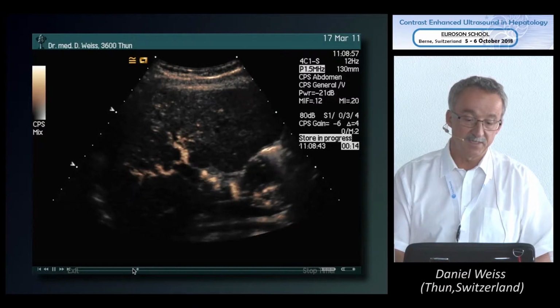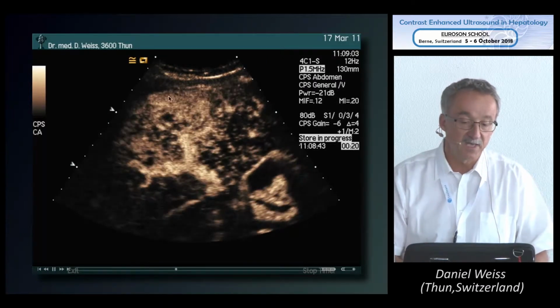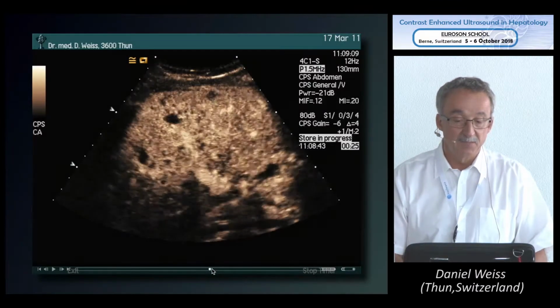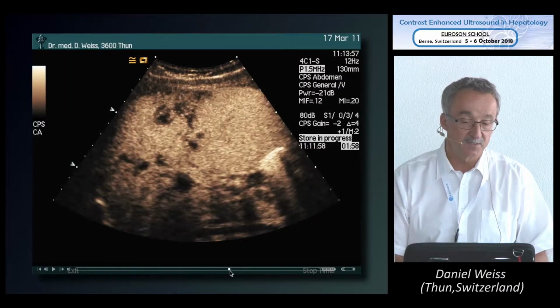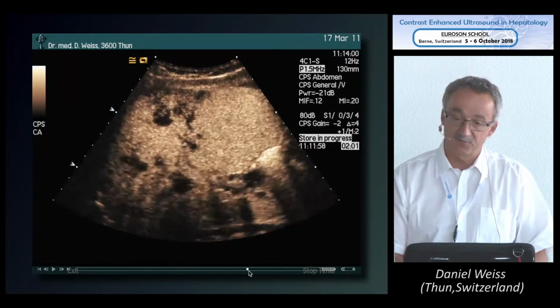And look what's happening. You see again these small calcifications, heterogeneous liver. You still have the inflammatory changes. You still have these holes, but they get much clearer. And you have not holes, you have a tunnel system. You see, there is something traveling through the liver which feeds from liver tissue.